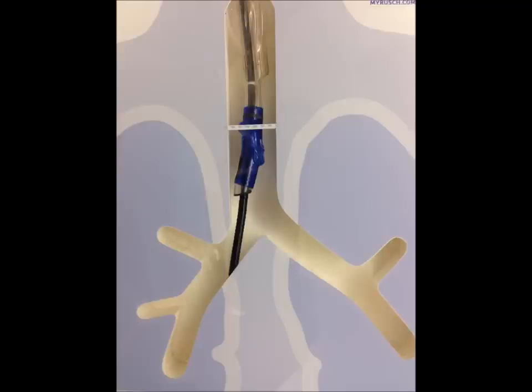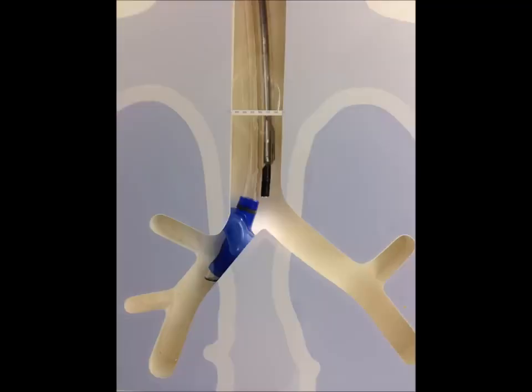So you'll see perfect placement, and you'll see some minor movements which cause sometimes major problems. In this setting, you can start to advance it, and here we're actually in good shape. This is a properly placed right endobronchial tube. There's a Murphy's eye here, so you're ventilating the right upper lobe. If you want to ventilate just the right side, then ventilate through the endobronchial port. You're ventilating all three lobes here.